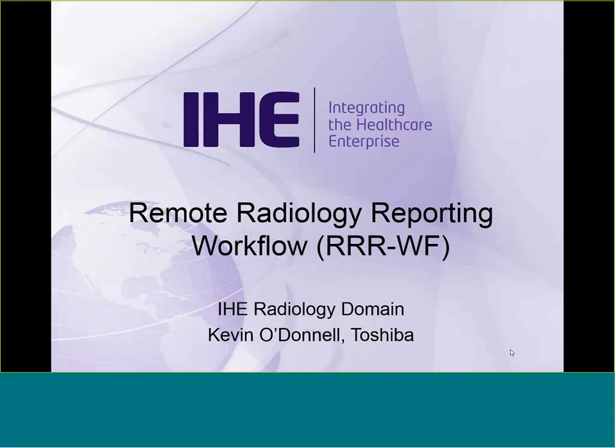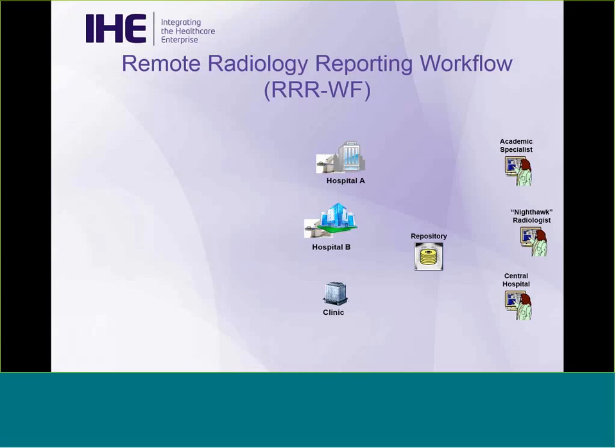So, good morning, everyone. I'm Kevin O'Donnell. I work with Toshiba and did the editing on the remote radiology reporting workflow profile. The idea behind this profile is that increasingly we've got communities of hospitals and clinics that are able to share imaging relatively easily between their sites. And once you've got that image sharing capability, then it's interesting to start looking at sharing certain workload, for example, radiology reading or radiology reporting.